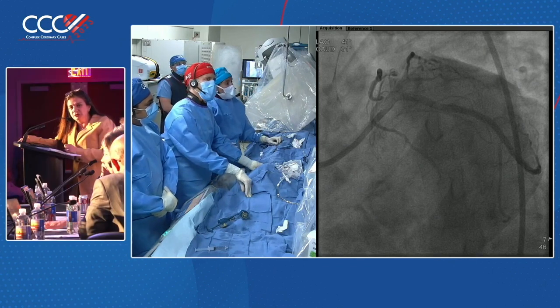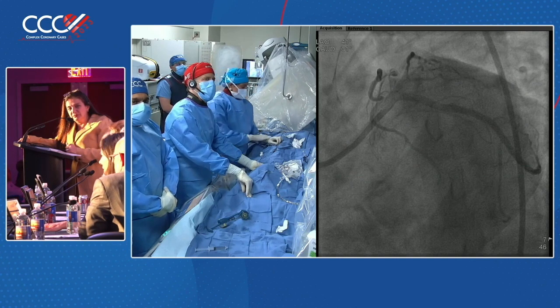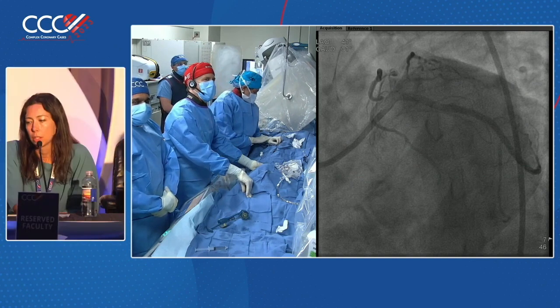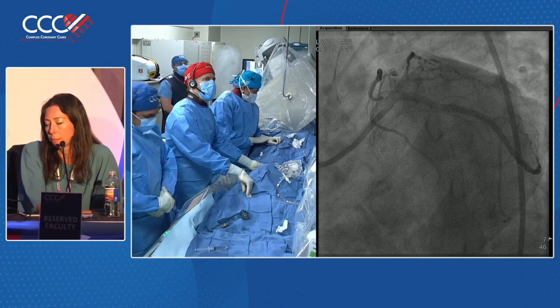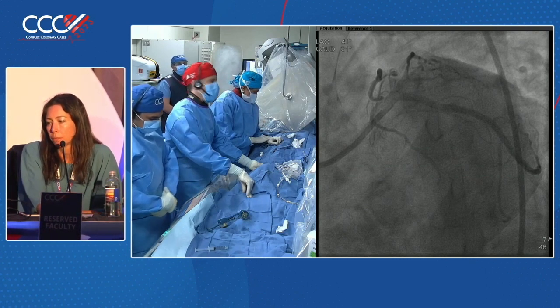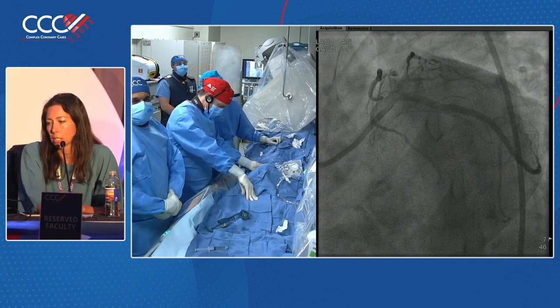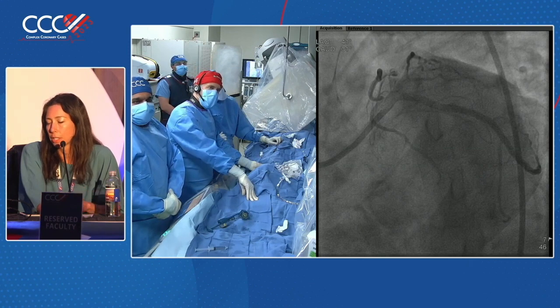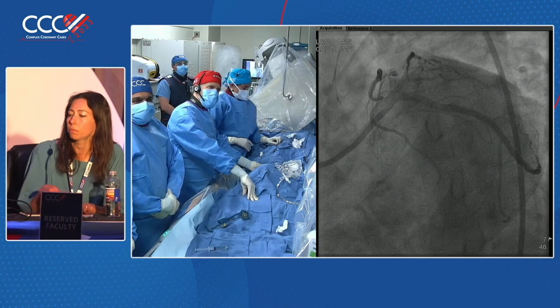Nadia, what would you do? Yeah, I agree. Just seeing the angiogram so far and not seeing the imaging yet, I think it looks like there's disease up to the ostium. Probably would be stenting LAD back to the left main. And then for the diagonal, I think that the approach that's described sounds like a good one. And the other thing is, if we had drug-coated balloons, this might be a consideration in the future, using a drug-coated balloon for the diagonal.